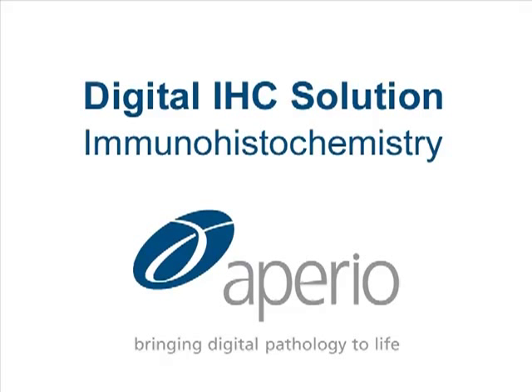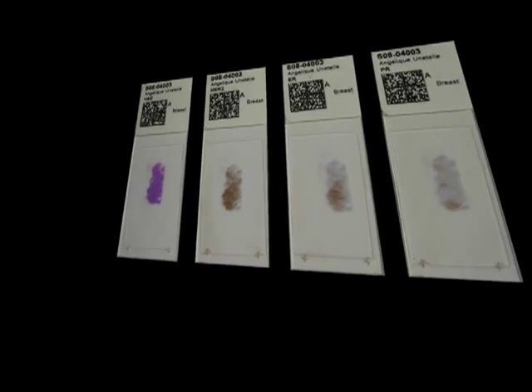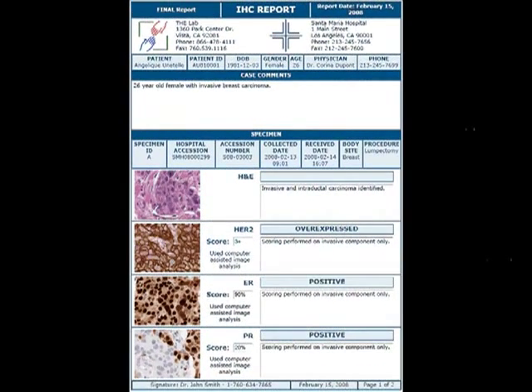Aperio provides a complete digital pathology solution for immunohistochemistry. Go from glass slides to professional reports in minutes.